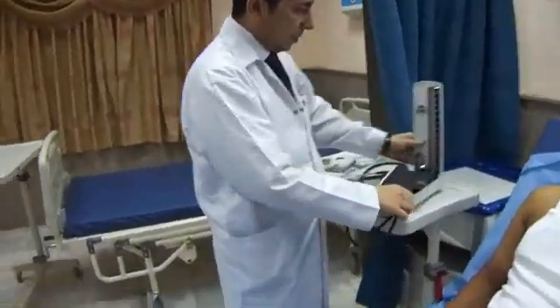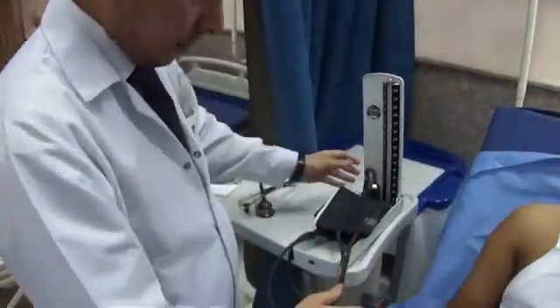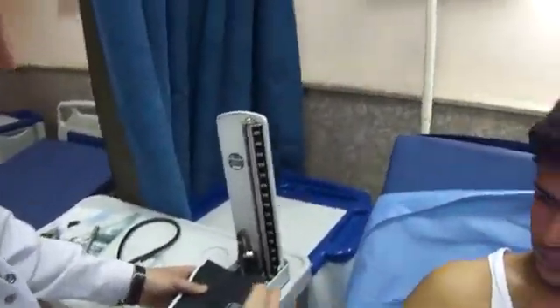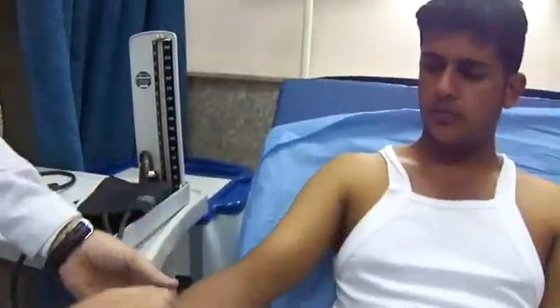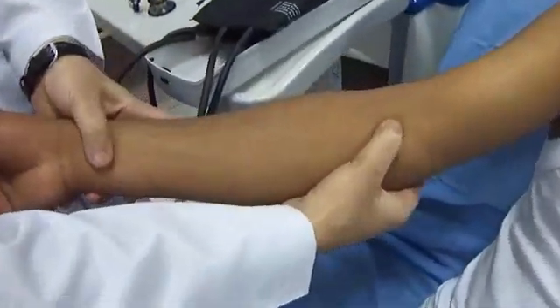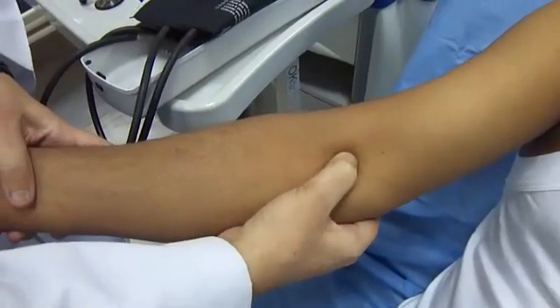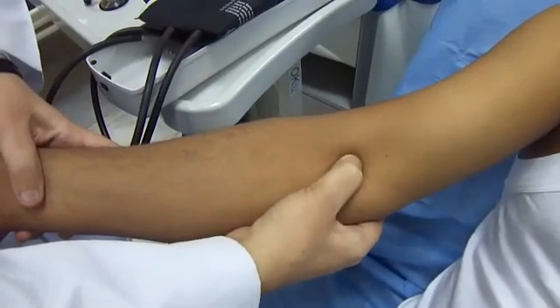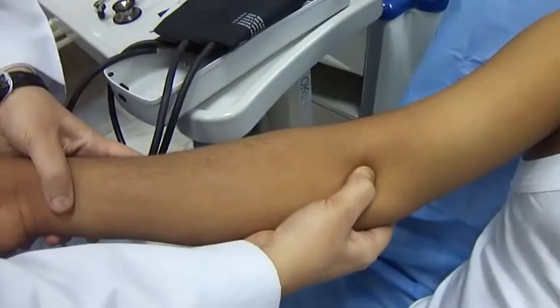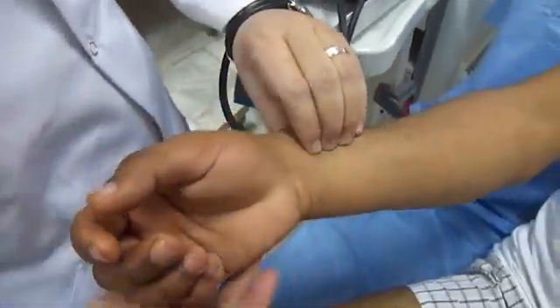First I'll check the blood pressure on the right side. I'll position the sphygmomanometer at heart level, then ensure the location of the brachial pulse — this is the brachial pulse. I'll also check the radial pulse for its patency.